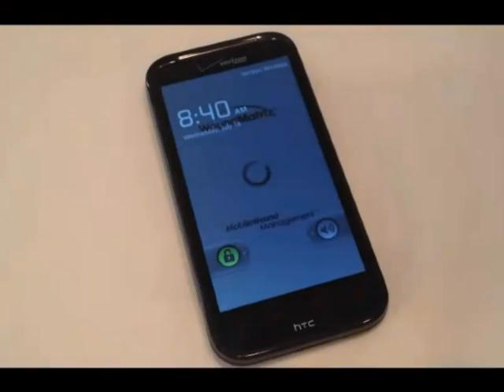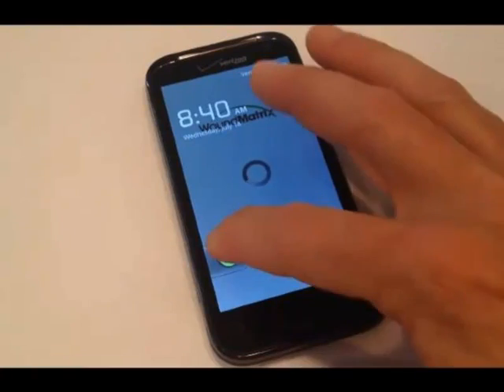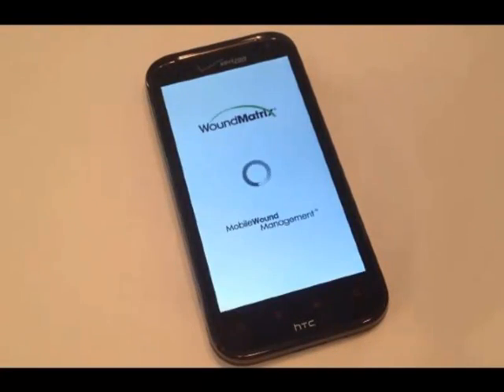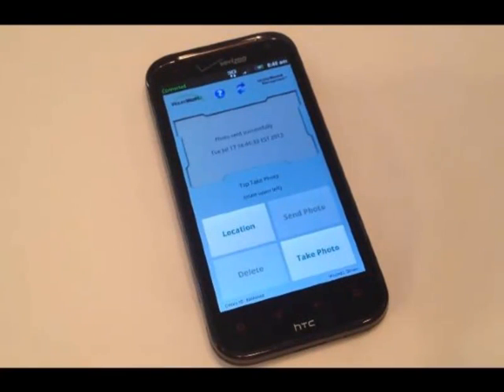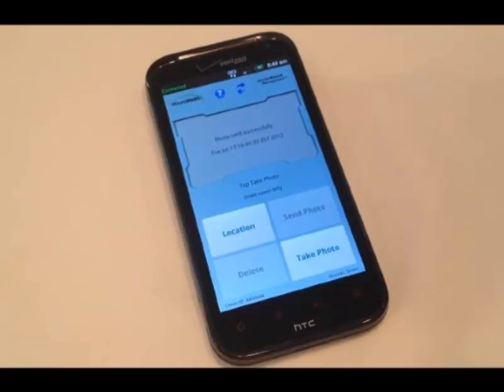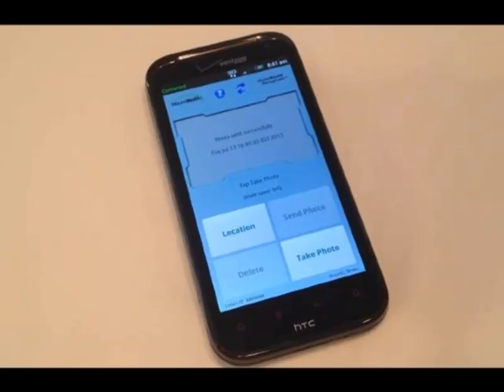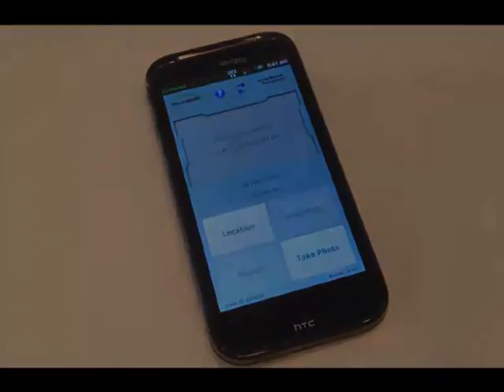After turning on your device, you will see four boxes at the bottom half of the screen marked Location, Send Photo, Delete, and Take Photo. Active or live boxes display in bold letters. Inactive boxes display in gray.